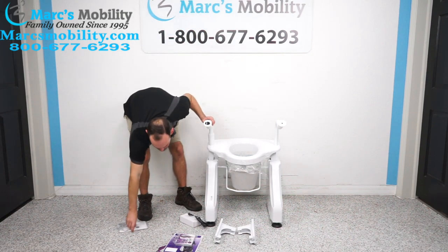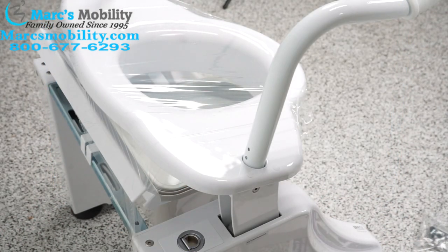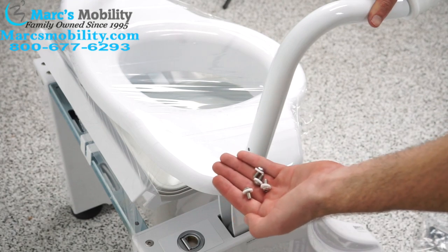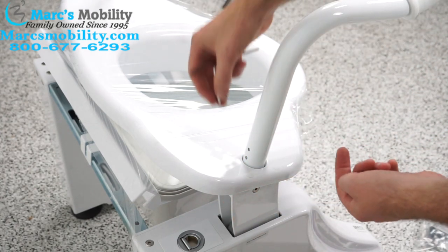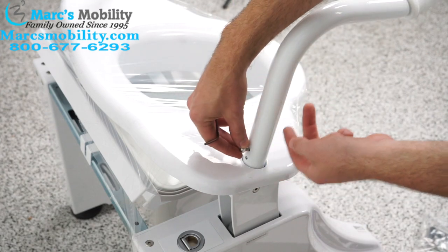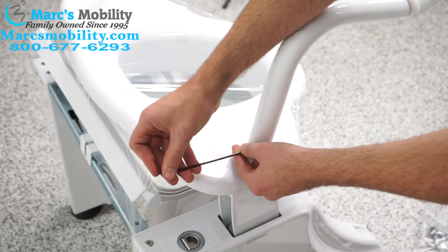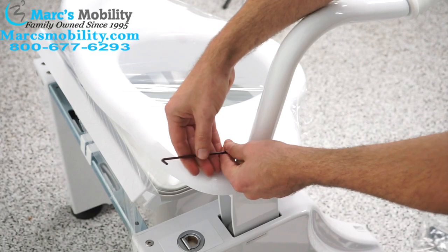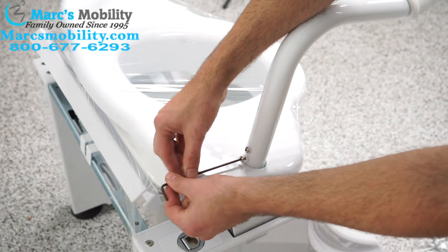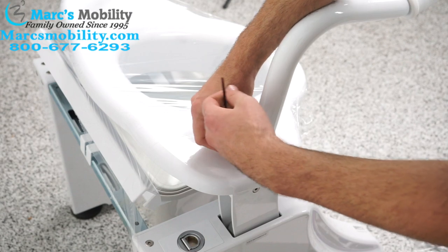Once the arms are on, we're going to get our Allen screws from the user's manual and install them in the back. On the back side of your toilet lift, in the arms, there are two little screw holes. Your toilet lift comes with four Allen screws with little plastic washers — two per arm. Your lift also comes with an Allen wrench. You want to do two screws on this arm and then two on the other arm.